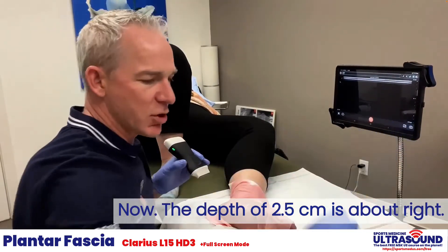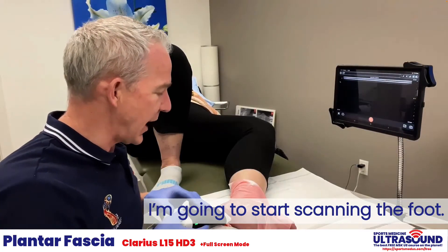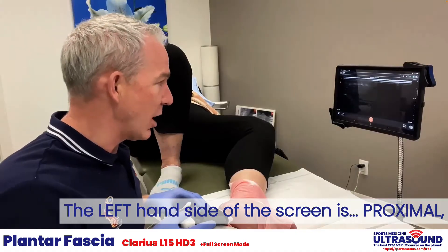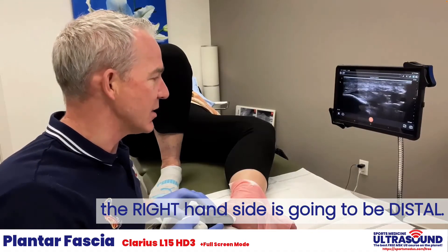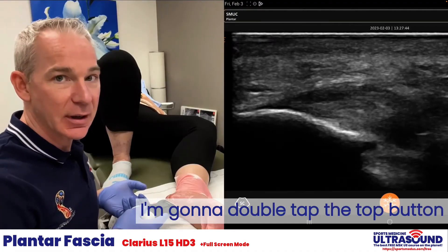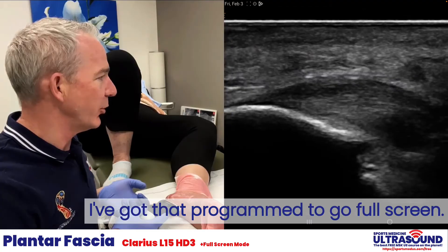I'll select the plantar setting. The depth of 2.5 centimeters is about right. I'm going to start scanning the foot. The left hand side of the screen is going to be proximal, the right hand side is going to be distal. I'll double tap the top button — I've got that programmed to go full screen.